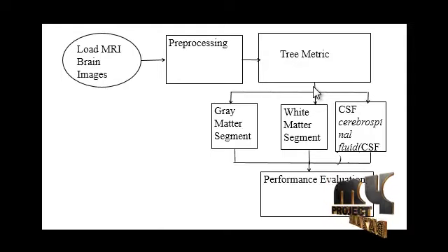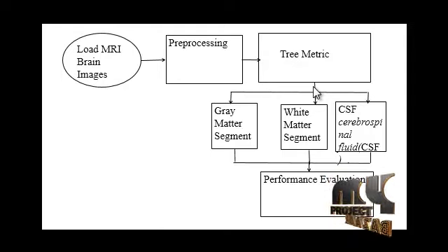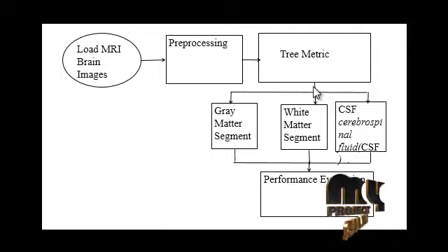To apply the tree metric graph cut algorithm to brain MRI segmentation, we perform pre-processing to create suitable inputs to the TM algorithm, and post-processing on the output segmentation returned by the TM algorithm to create a meaningful brain segmentation, classifying the tissue at each voxel.